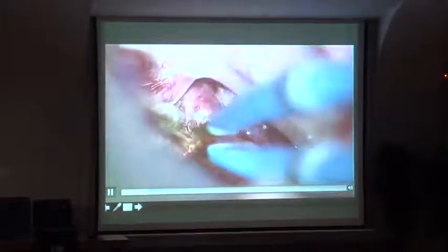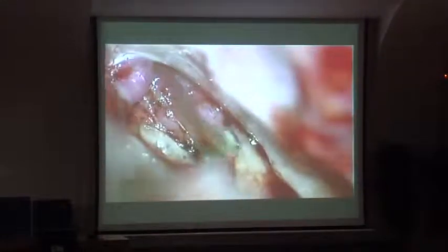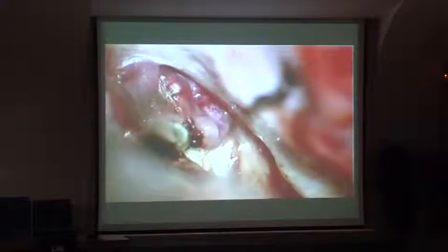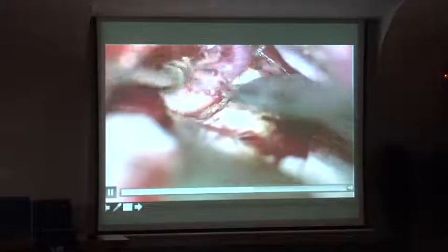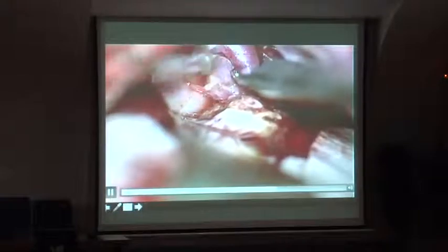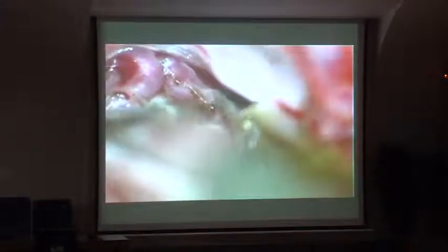And here you're doing surgery, a small anterior craniotomy. You just follow the falx, and you're going to find this vein, and all you do is disconnect that vein. You don't have to worry about where the arterial feeders are. You find the vein, all you have to do is coagulate or clip that vein, and here it is, just dissecting that. So it's a pretty simple operation. And here you see the clip coming.